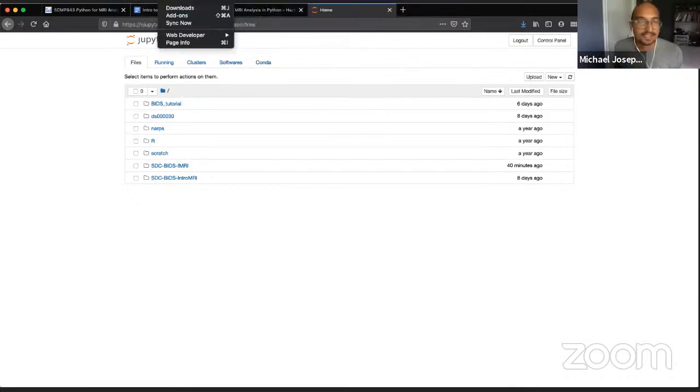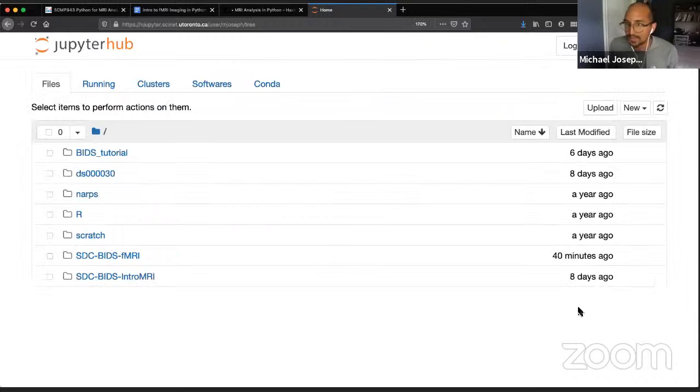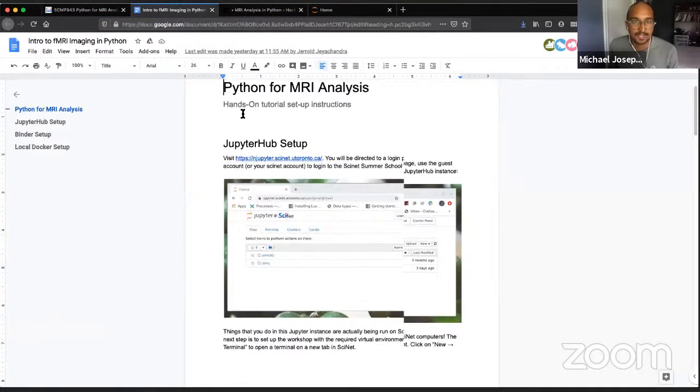All right, let me just make this text a little bit bigger. So did anybody have any trouble getting set up yesterday? Because we'll be running through a couple notebooks. So if anybody had some issues, we can run through setup again. If not, you can find the setup instructions on our setup page.